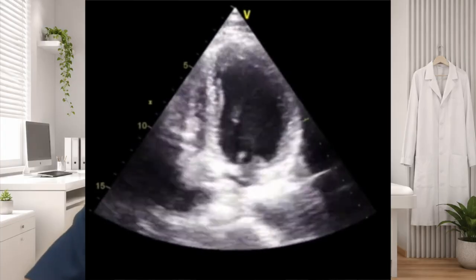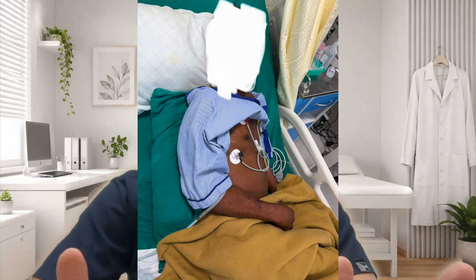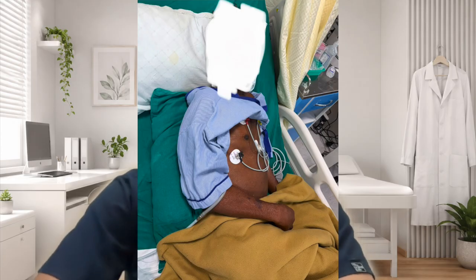So first, it's the patient's positioning. As we have told in the previous videos also, whenever possible, turn the patient to the left lateral. This brings the heart closer to your chest wall and moves the lung away from your imaging window. But this may not always be possible in a patient who is critically ill. That's very much okay. It's not a problem. The apical view can still be attempted in the supine position. This may simply need a better searching and looking more laterally.